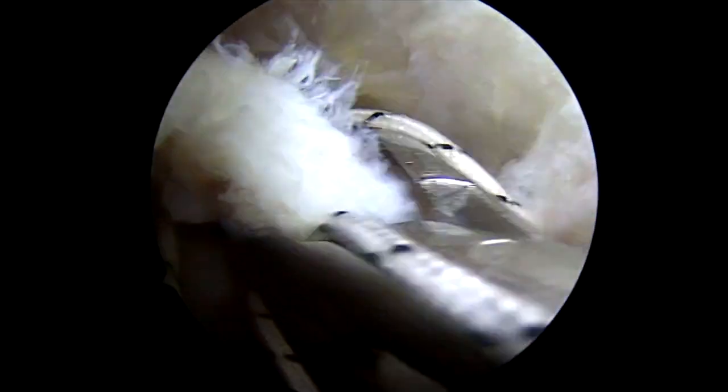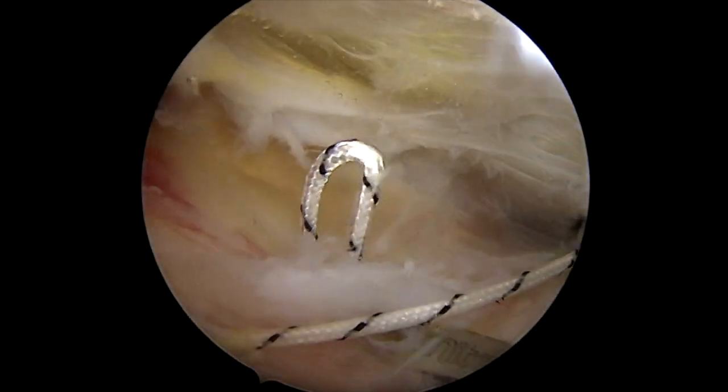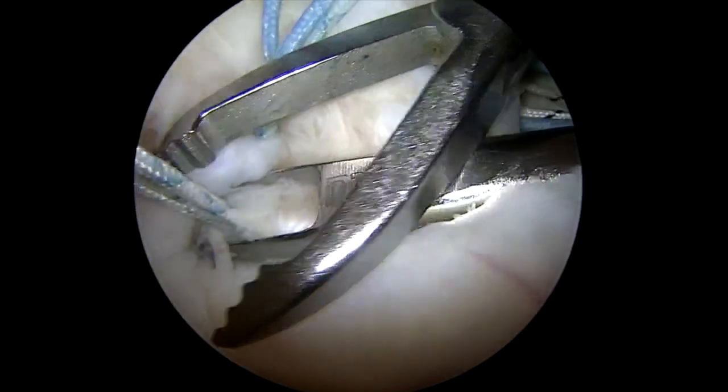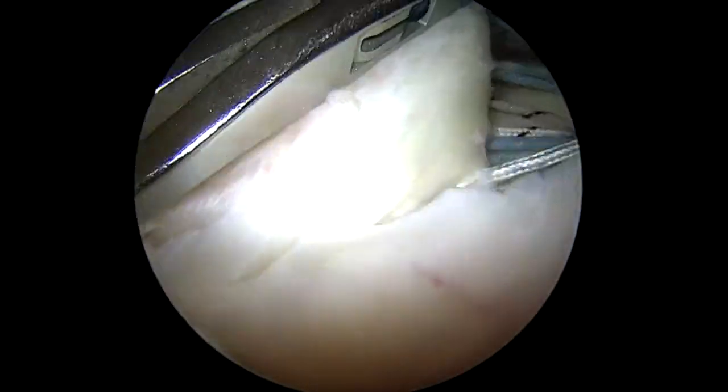We're going to fast forward here a little bit because this portion of the operation is meticulous — we'll pass all 12 of those sutures and it's kind of the same thing on repeat. There's the last suture being passed, and now we've got all 12 sutures passed.